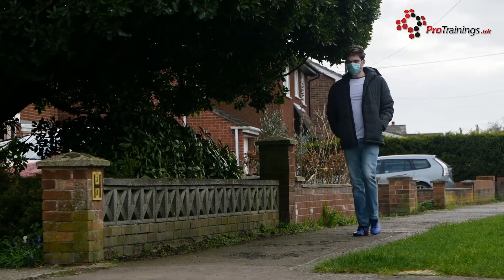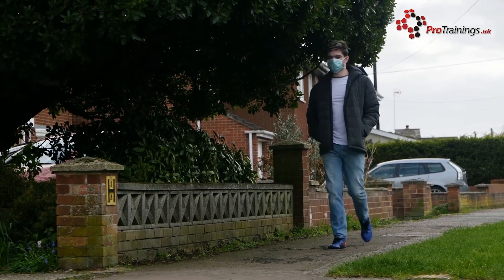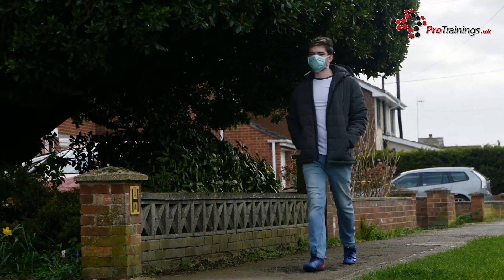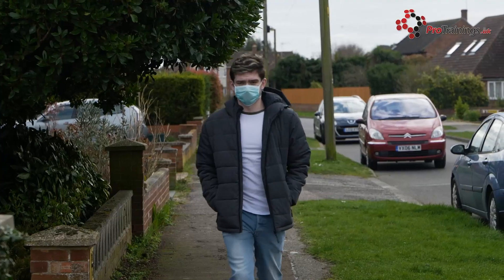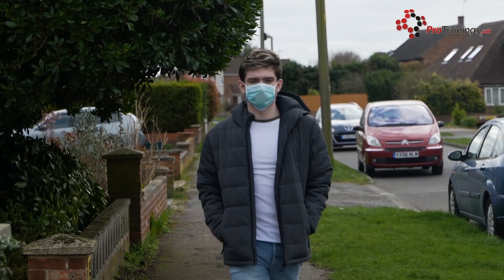The FFP respirators should be changed after each use, if breathing becomes difficult, if the respirator becomes damaged, or if it becomes obviously contaminated with bodily fluids such as respiratory secretions.